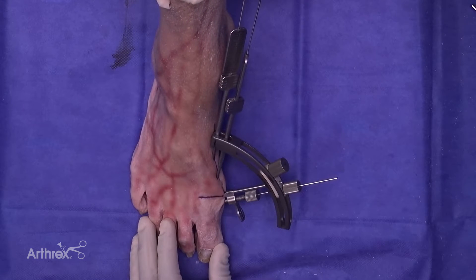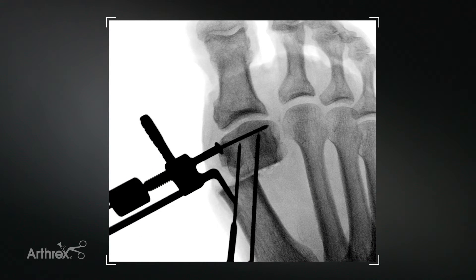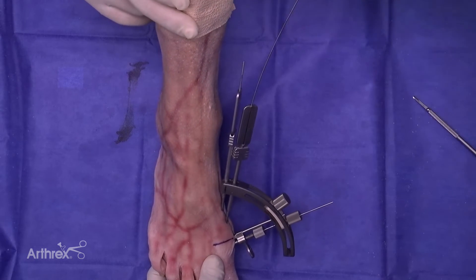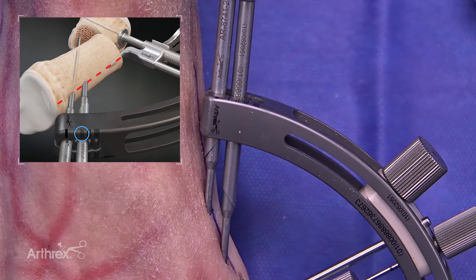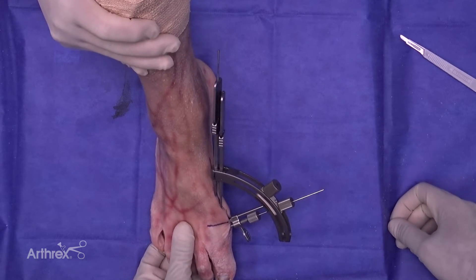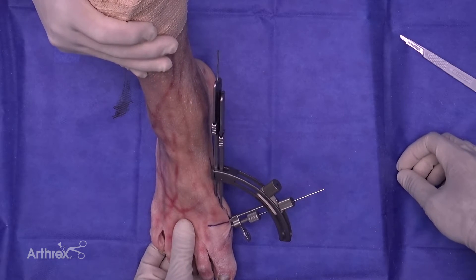The guide wire is inserted through the sleeve and we make sure we are bicortical with purchase of this wire prior to inserting into the capital fragment. The next step is to remove the temporary guide wire and to adjust the position for distal fixation. Next, we're going to move it into the slot on the side. Another stab incision is made and blunt dissection is carried down to bone, ensuring that the bevel can lay flush with the first metatarsal.